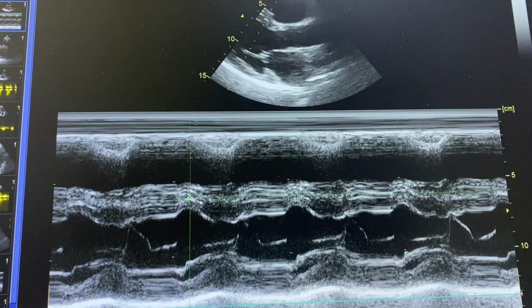So we are going to measure like that. Since it is thick enough, we see everything. So it will be the leading edge of IVS. We measure up to its trailing edge. We shall get that measurement, and it will be around, if you see it clearly there, it is almost in the LVH, and it is 1.3. It is LVH.